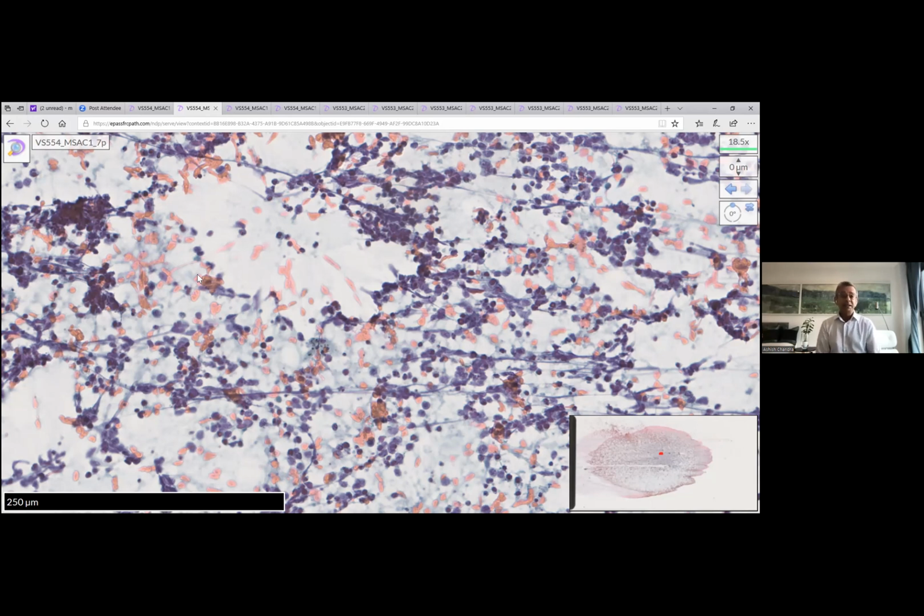Thank you, Tony. Yes, absolutely. The other differential that comes into play is a basaloid squamous cell carcinoma, particularly if it's a head and neck lymph node, but also could be in a mediastinal location. Look for keratinization or more abundant cytoplasm somewhere. So yeah, all really valuable comments there.